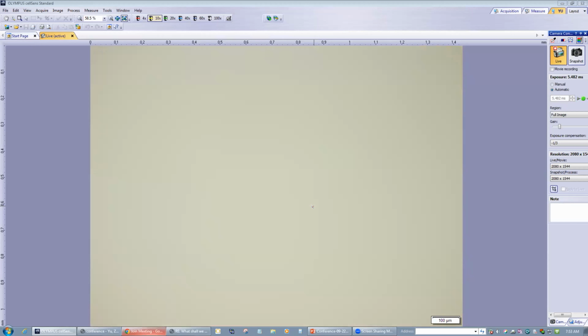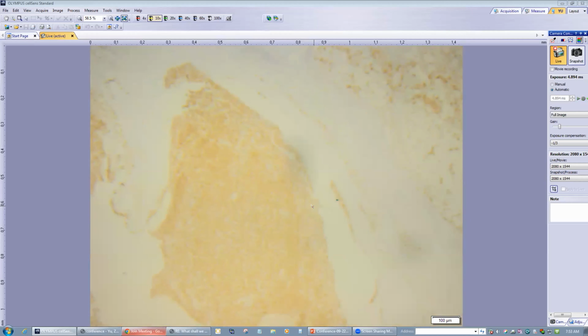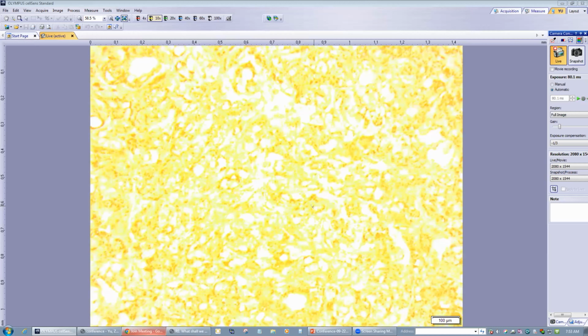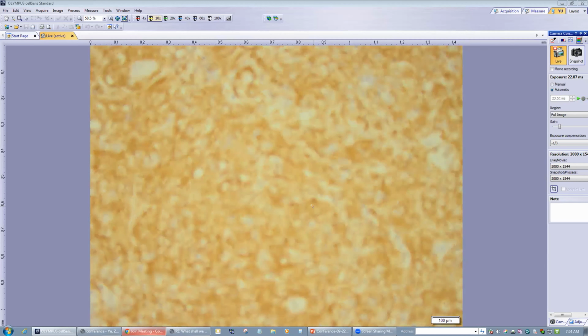Now for this tumor, you want to do immunos. This tumor is like a perivascular epithelioid cell tumor, a PEComa-ish tumor. So if you do HMB45 or Melan-A, they are usually positive. This is the HMB45 done on this case. The brown is positive. You can see the tumor cells are strongly positive for HMB45. S100 is usually negative. SOX10 I did on a recent case was also negative. But HMB45 should help you make the diagnosis.